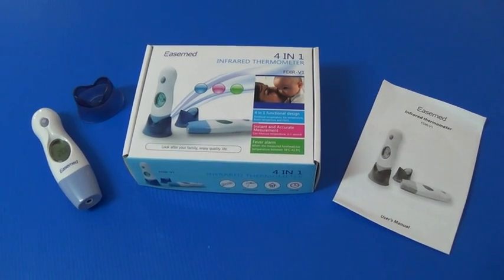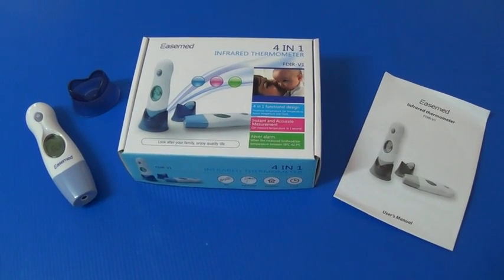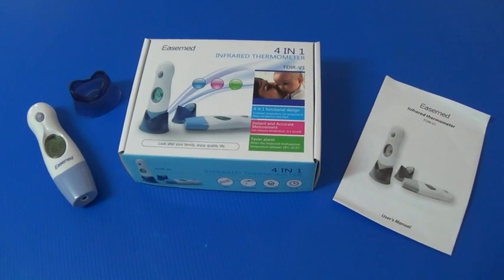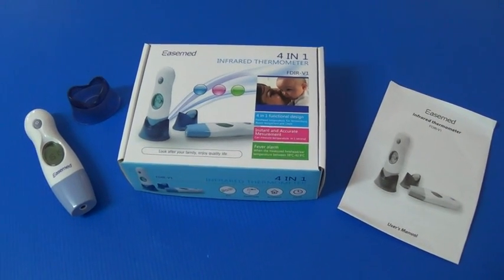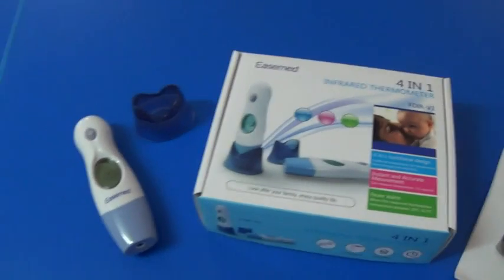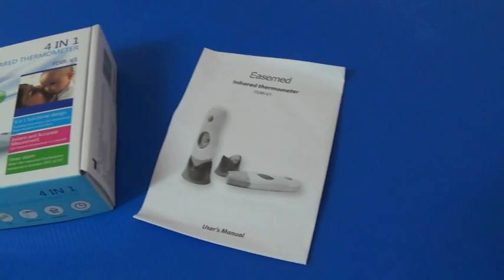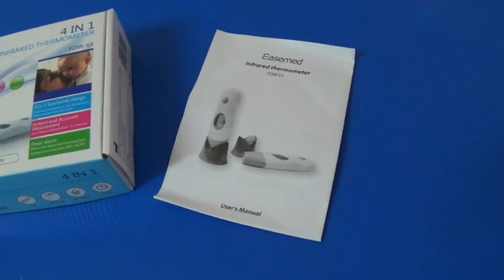Welcome. My name is Tania from Relax and Play, and I do thank you for purchasing the 4-in-1 infrared thermometer from me. When you receive your package you will receive quite an attractive box, the thermometer and base stand, and some detailed instructions on how to use the product.